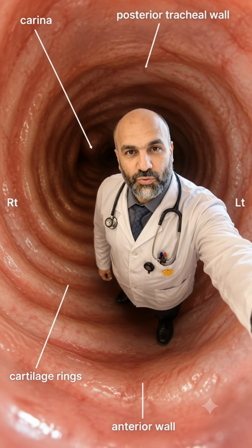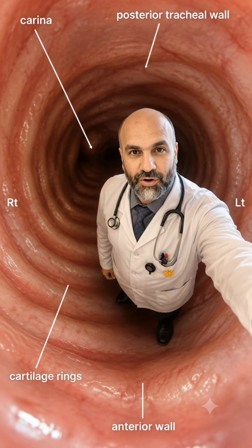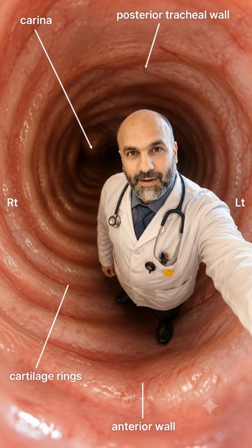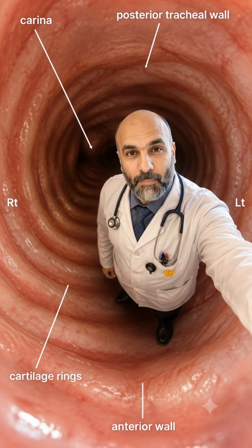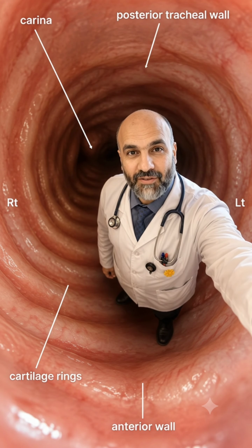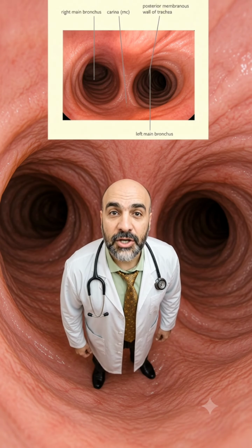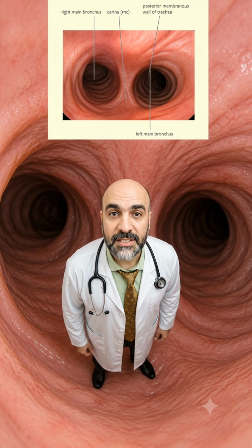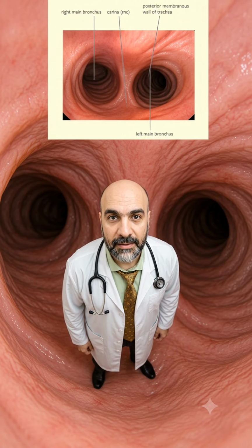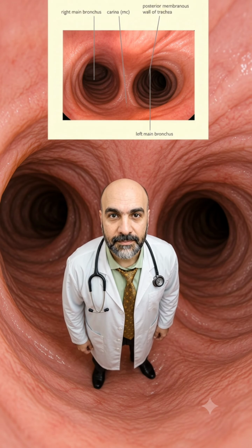As we advance through the trachea, we can see the cartilage rings and the anterior wall. We can also see the posterior membranous wall, and ahead of us is the carina, where the trachea divides into the right and left main bronchi. This is the carina, where the trachea divides into the right and left main bronchi. From here, we can clearly see both main bronchial openings.